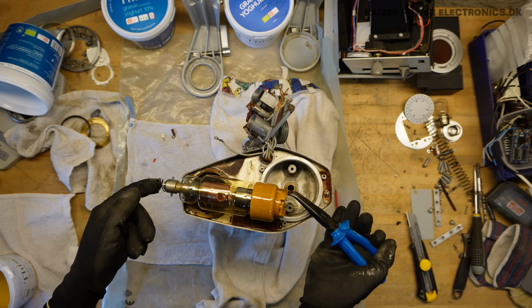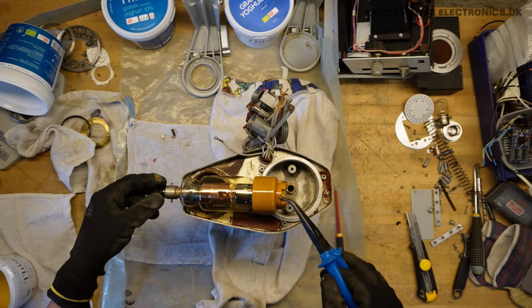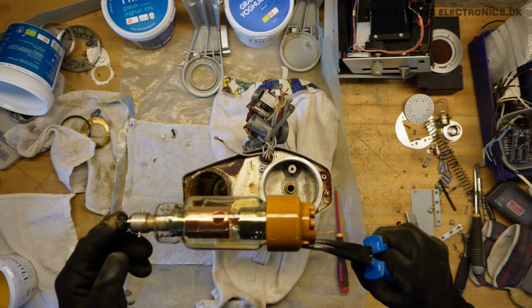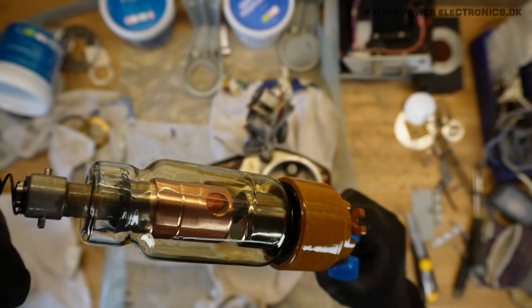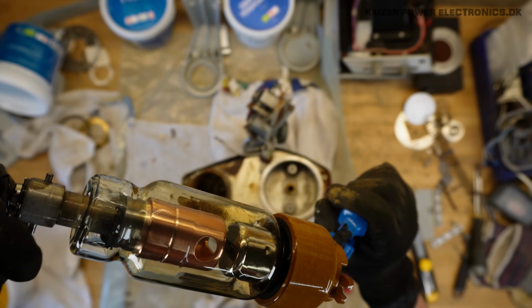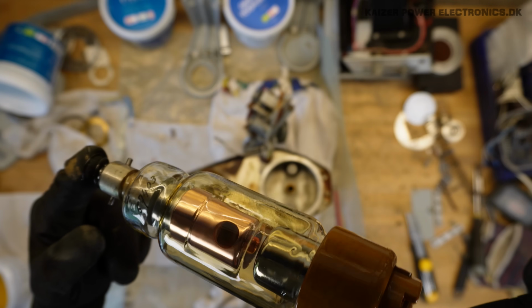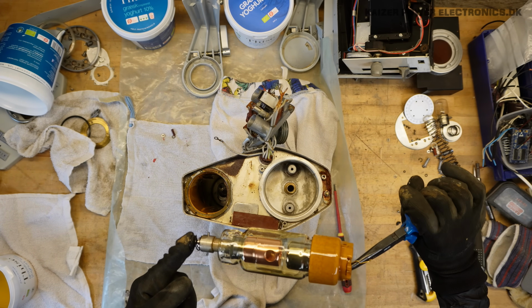Okay, so the focal point change is actually shifting the cathode and not the anode. That's quite interesting. So let's just take a closer look at the tube here. We can look up into the cathode there, maybe. It's very hard to get on camera. But we can see the window for the X-ray there from the anode. And looking into it, I can see that there is quite a bit of wear on the anode plate there.